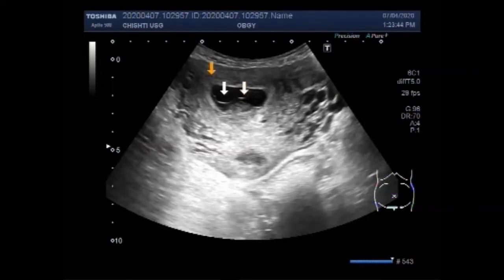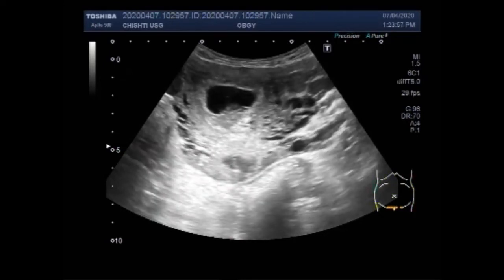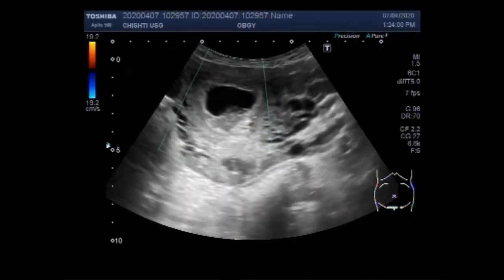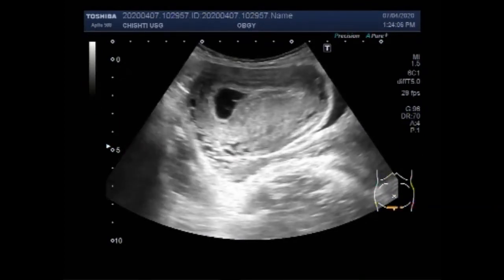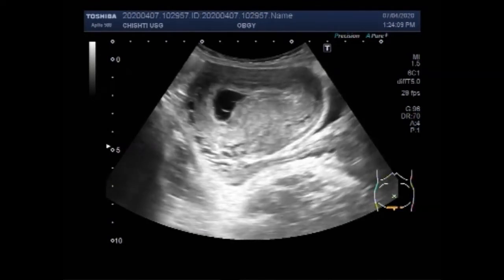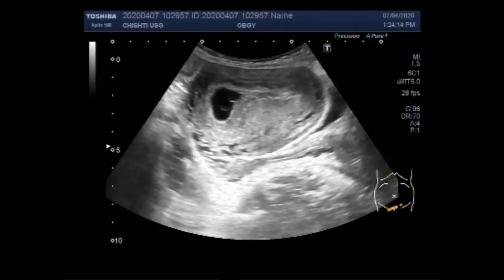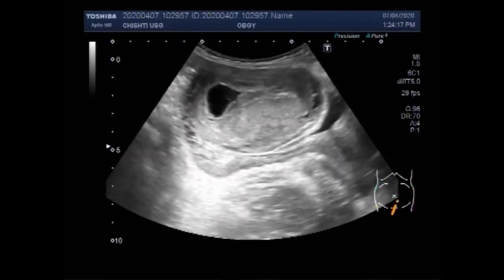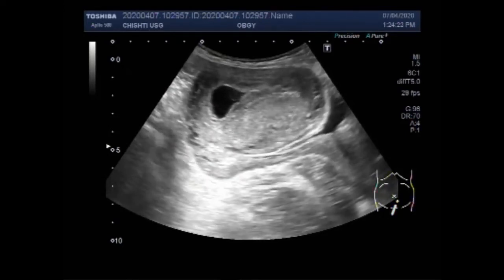You can see the products of conception inside the gestational sac, but there is no fetal pole and no umbilical vesicle, also called the yolk sac. The fetal pole is usually identified at 6.5 weeks with transabdominal ultrasound imaging and at 6 weeks with transvaginal ultrasound imaging, although it may not be seen until 9 weeks in some cases. When the fetal pole measures 7 mm or more, a fetal heartbeat should be detected.